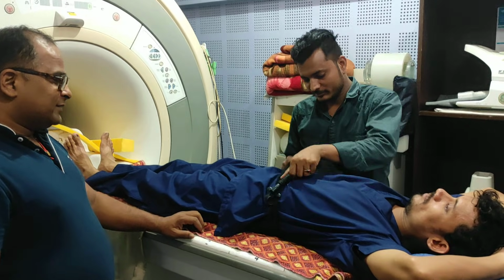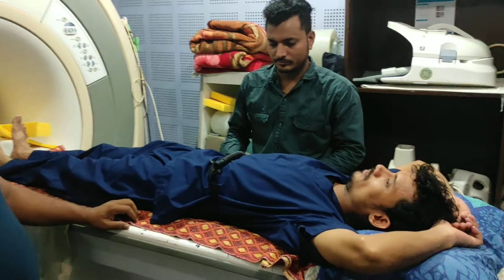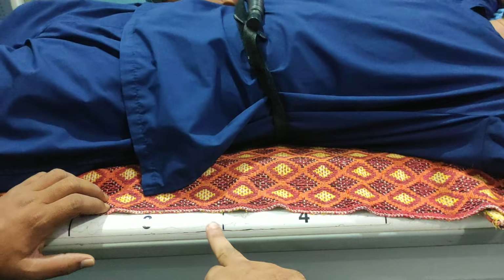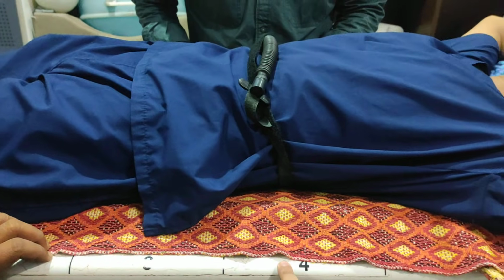Today I am going to show you how to do MRCP on Brivo MR355 1.5 Tesla GE. First of all, you have to set the position of the patient. This is an inbuilt table coil. So I am placing the patient in the 3-4 body array coil.